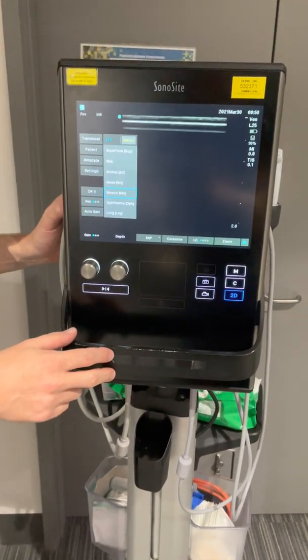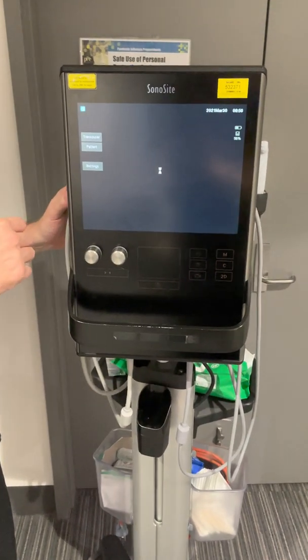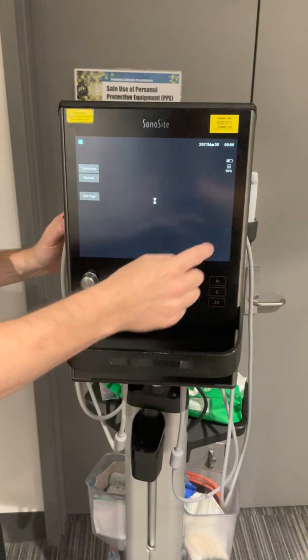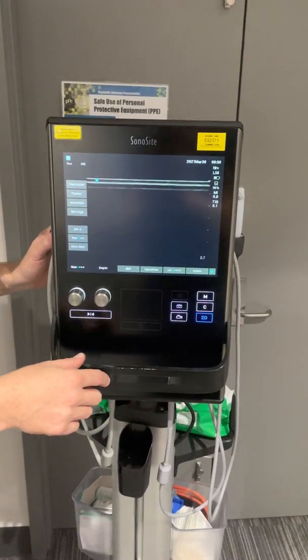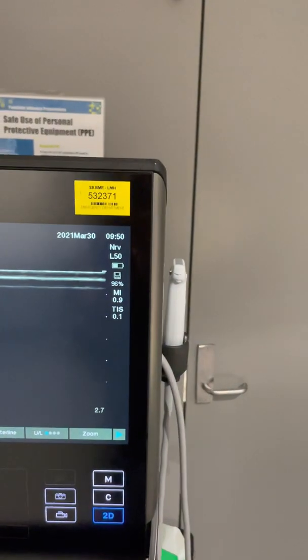To switch, you just press the switch button and it will change between transducers to the other side, and after a small delay it'll usually display what transducer is on this side. So now it's changed to the L50 and it's on a nerve setting NRV.